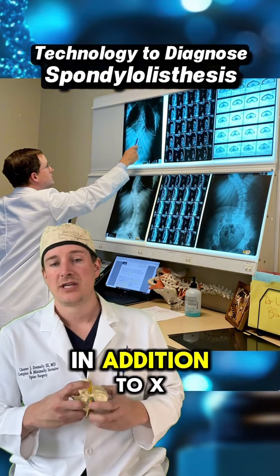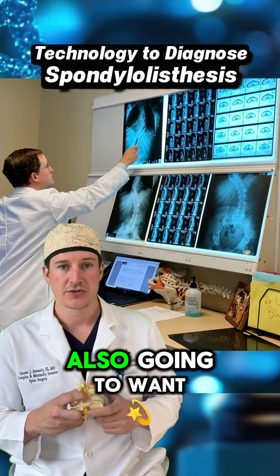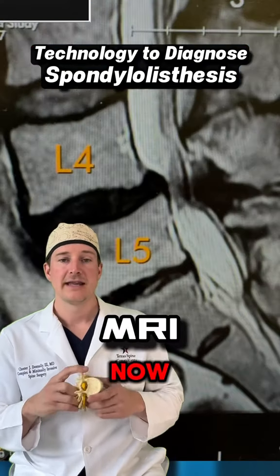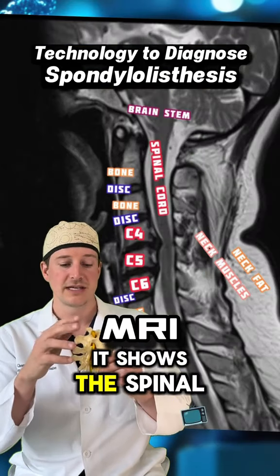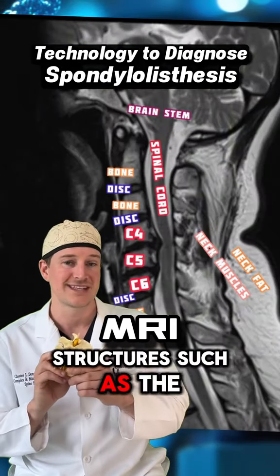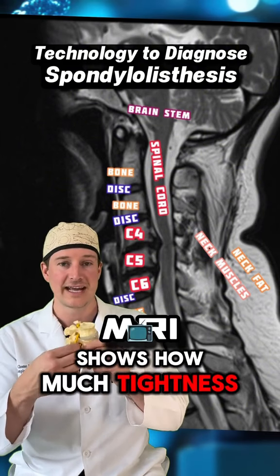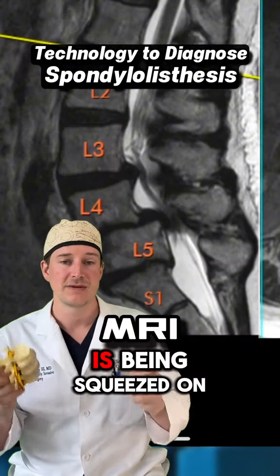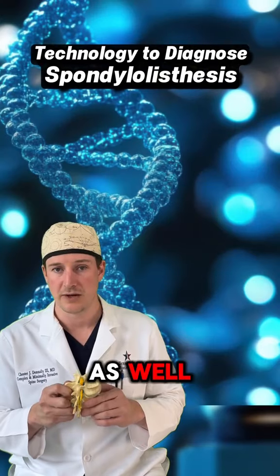In addition to x-rays, essentially every time a spine surgeon is also going to want and is going to need an MRI of the spine. Now the MRI is different because the MRI shows the nerves, it shows the spinal structures such as the thecal sac, the spinal cord. It shows how much tightness from either thickened tissue or from instability of the bones is being squeezed on that nerve. So an MRI is critical to the diagnosis as well.